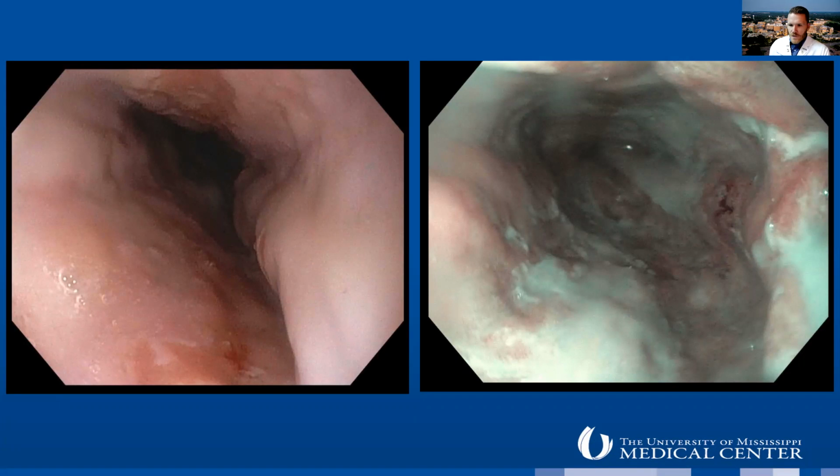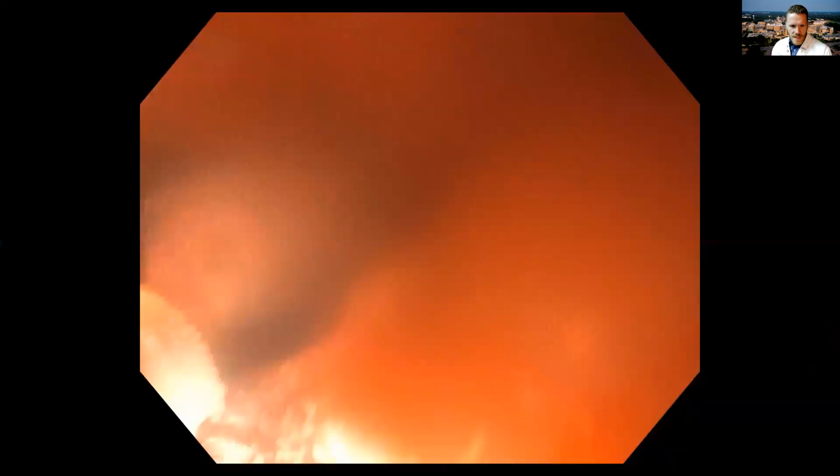So this is just a quick video of a patient that we've been treating with cryoablation. You see the white light and the narrowband images on the left of the area of dysplasia. This is a patient that's already had some treatments, and so you notice the white light imaging has some heterogeneity to it. But in any event, we'll see here in the video, you've got the spray catheter out the tip of the scope, and then you have a decompression tubing there that's placed prior to you beginning spraying. And you're just going to work your way around systematically, freezing a segment at a time.